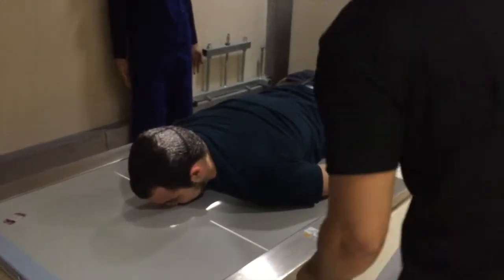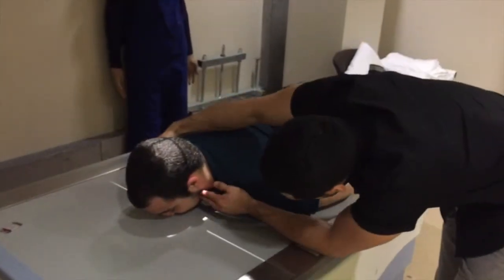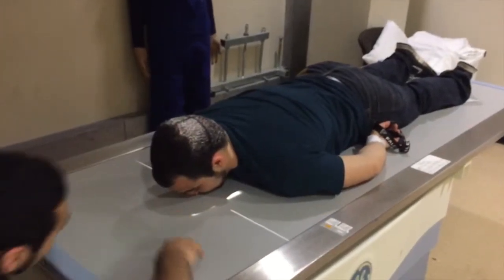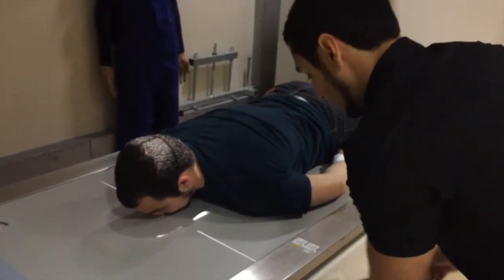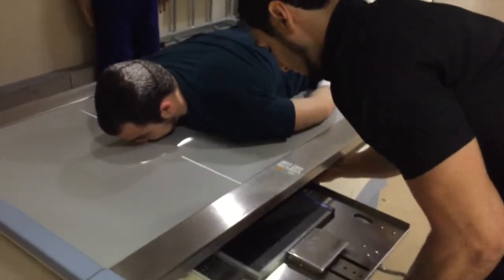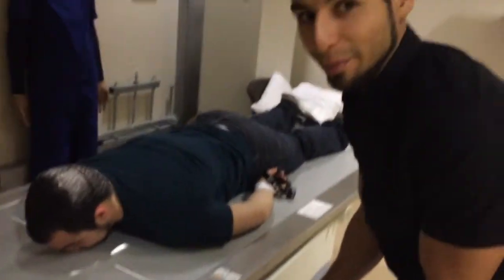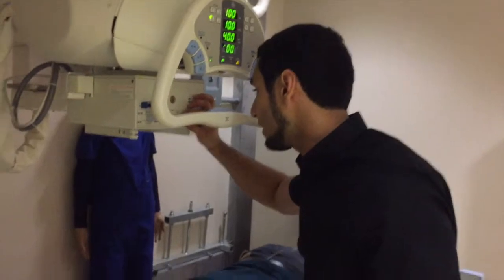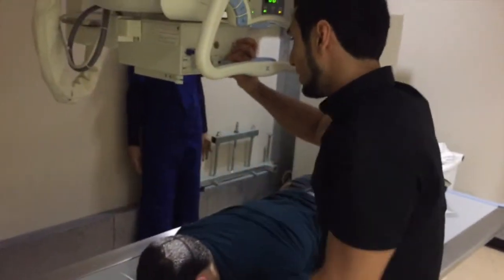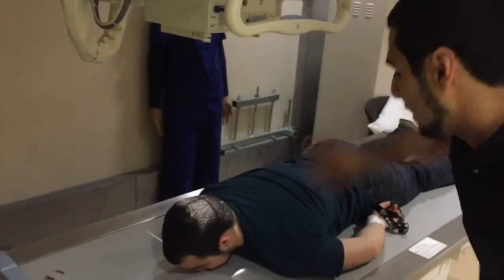Once the tube is aligned in position, mastoid processes have been felt, and orbital margins have been cleared for no tilt or rotation. We align the bucky with the tube CR. As you can see, this is an 8x10. Collimate to the appropriate size of interest, which in this case I'm going to keep at an 8x8, just to make sure I have all the anatomy demonstrated.